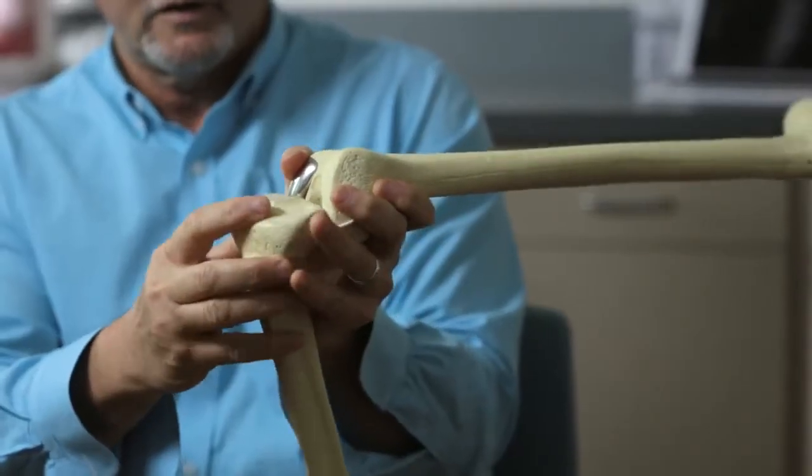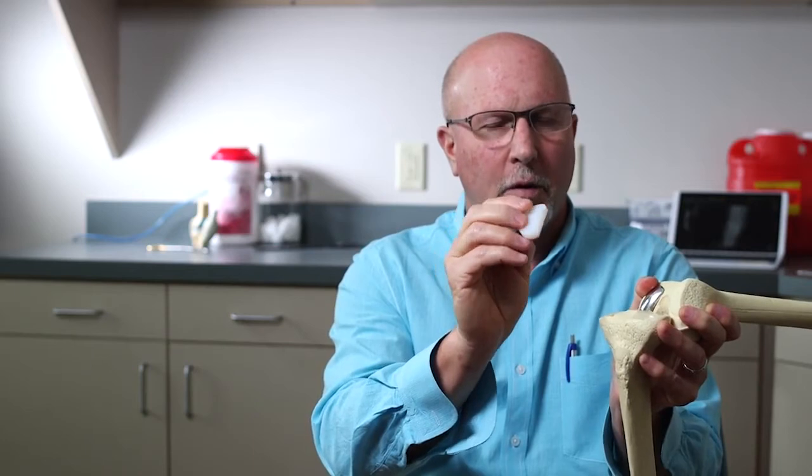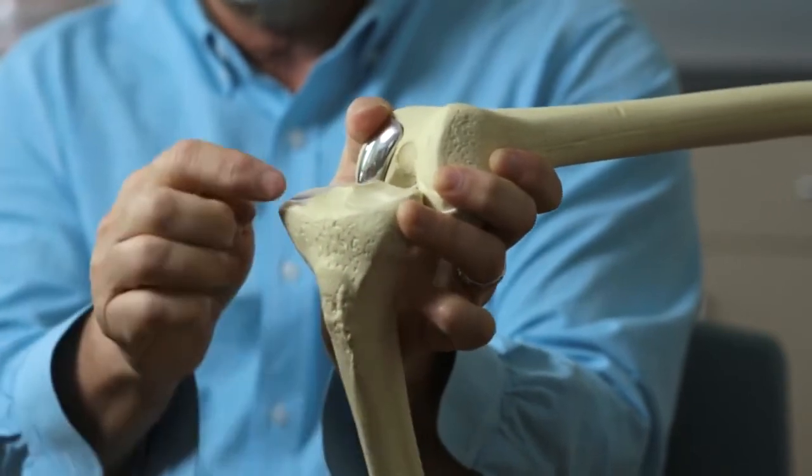With the partial knee resurfacing technique that I use, instead, through a small incision, a plastic wafer, very high quality, durable plastic, is inlaid into a depression in the bone, leaving a thin rim of natural bone all the way around it.